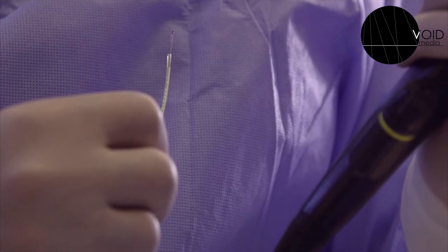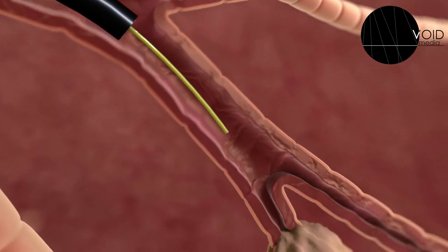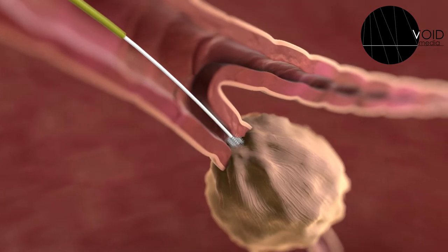We can also perform bronchial brushings, where we pass a brush through the bronchoscope and agitate the part of the lung where we want to get samples from.